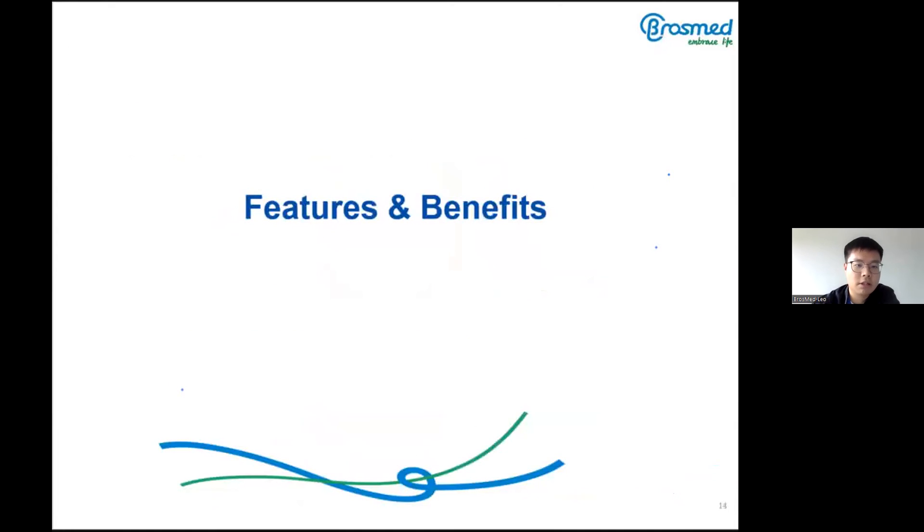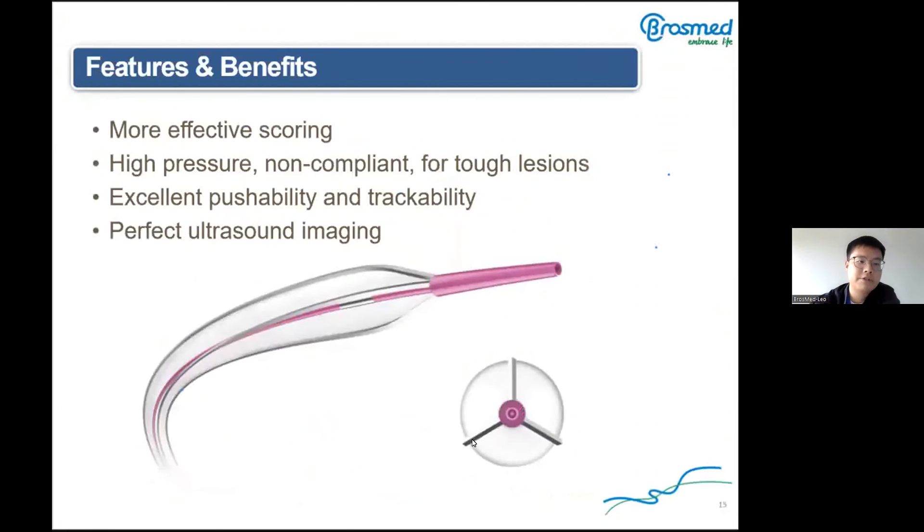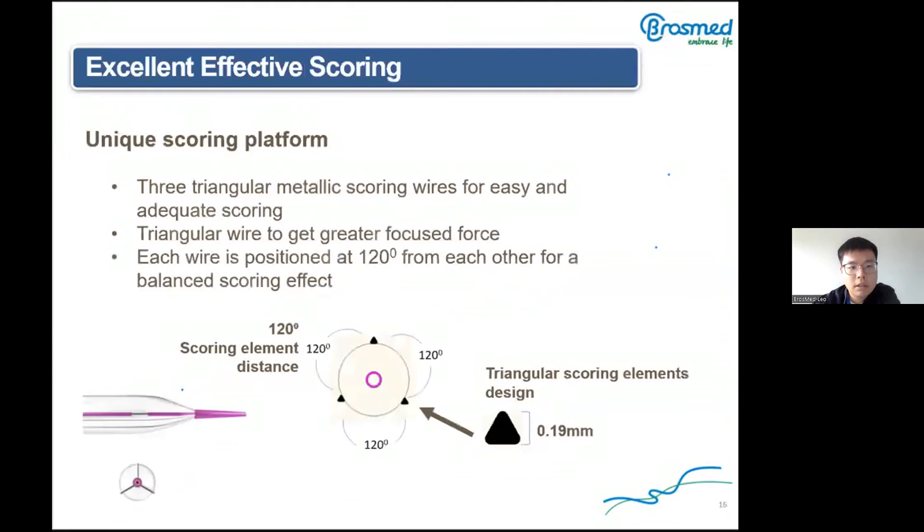Looking at the features and benefits: it has more effective scoring because of the unique scoring design and balloon material, combined with high pressure and non-compliant properties to treat hard lesions. Advanced laser welding technology gives excellent pushability and trackability, as well as high ultrasound detectability. The Triwitch has a unique scoring platform with three triangular metallic scoring wires for easy and adequate scoring. The height of the scoring element is 0.19 mm, and due to its triangular shape, it achieves a great focal force.